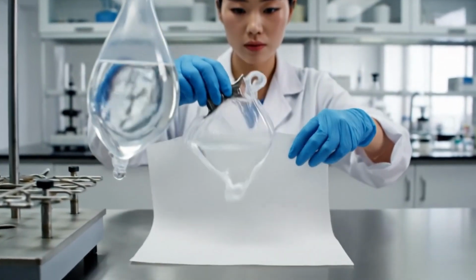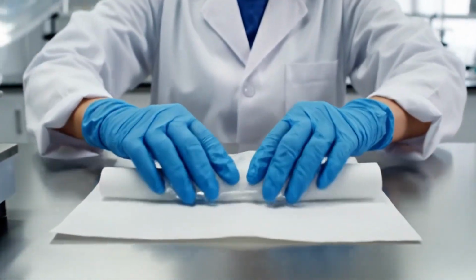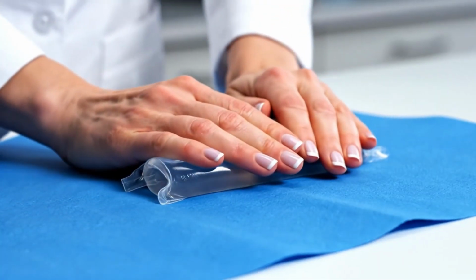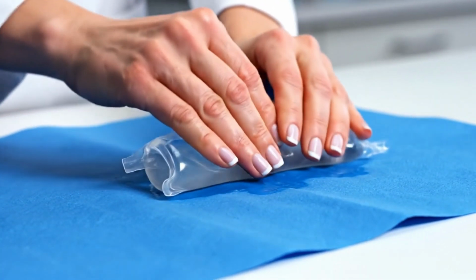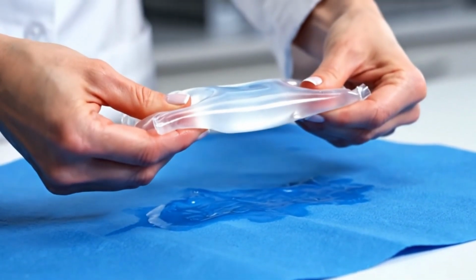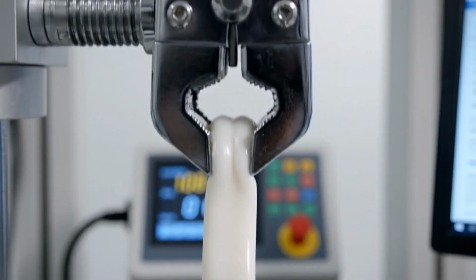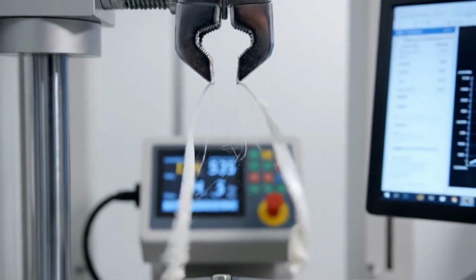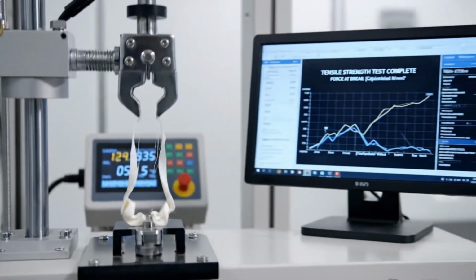The water leak test is simple but effective. If even a microscopic drop escapes, manual verification ensures that our automated electronic tests from Phase 3 are 100% accurate. We test the molecular pull of the latex. It must be able to stretch 700% of its original length before snapping.